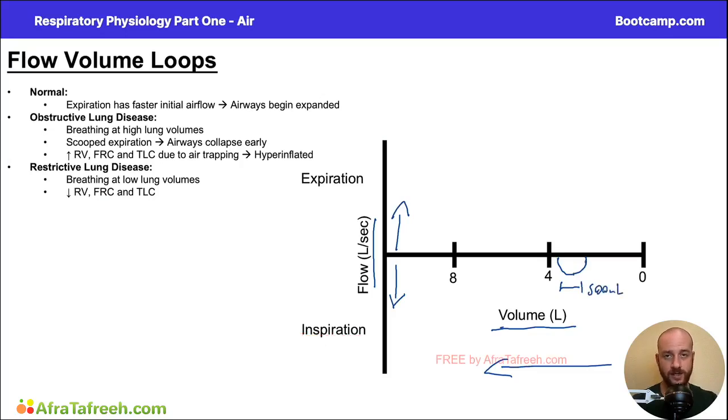As we are inspiring, our curve is going to be going this way as we are inspiring volume into the lungs. And the same thing is going to happen as we expire our tidal volume. The curve is going to be moving this way as we expire that 500 milliliters.